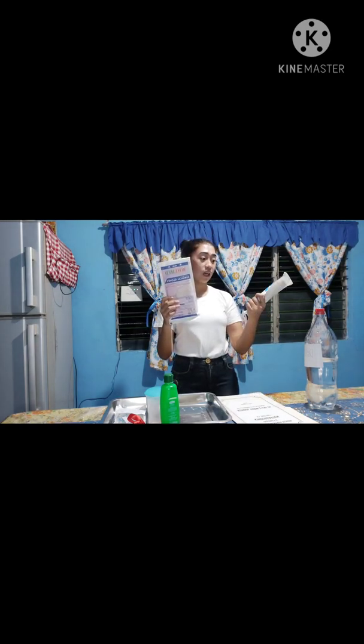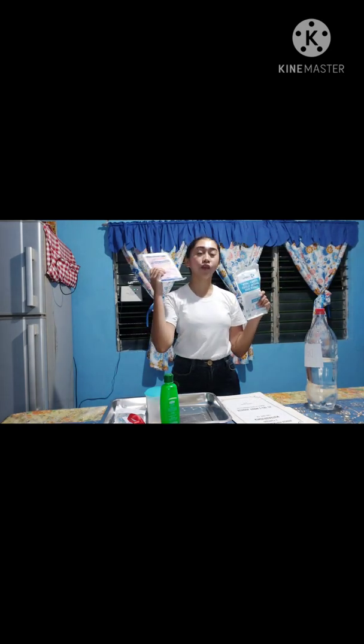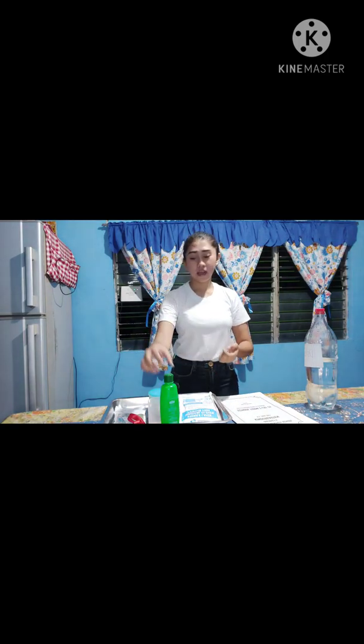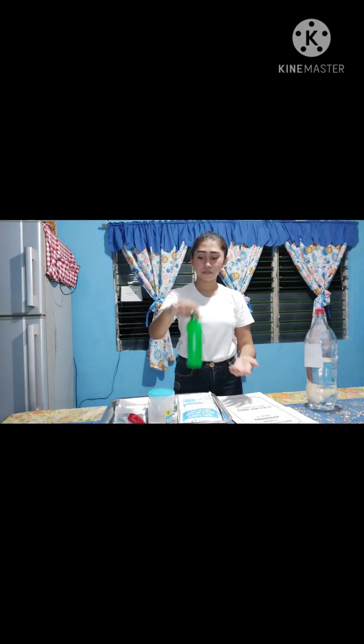You should prepare 2 pairs of gloves, one for you and one for the doctor or the IV therapy nurse. The next is to prepare dry cotton balls, and then an alcohol swab, alcohol, an IV splint, and the fluid solution. Don't forget the waste receptacle and the sharps bottle.